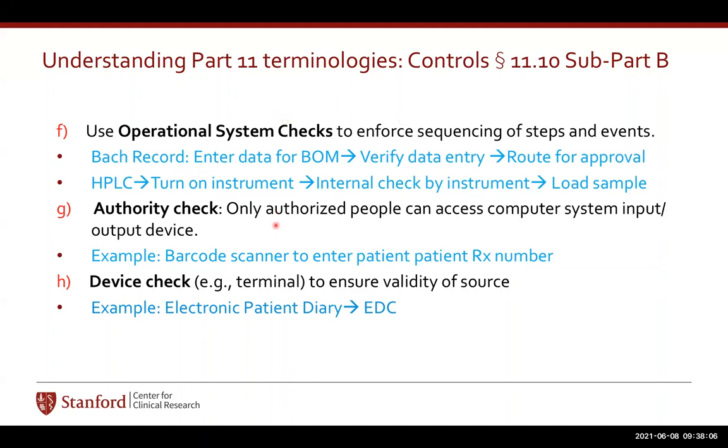Authority check, you already know: username, password. And the device check is also very important. I mentioned that earlier: you are in a field and you have some kind of device that is talking remotely to the server, and you are entering the data with that device. Sometimes we can also call it a terminal, you know. So these are the things that are important to understand of what FDA said.